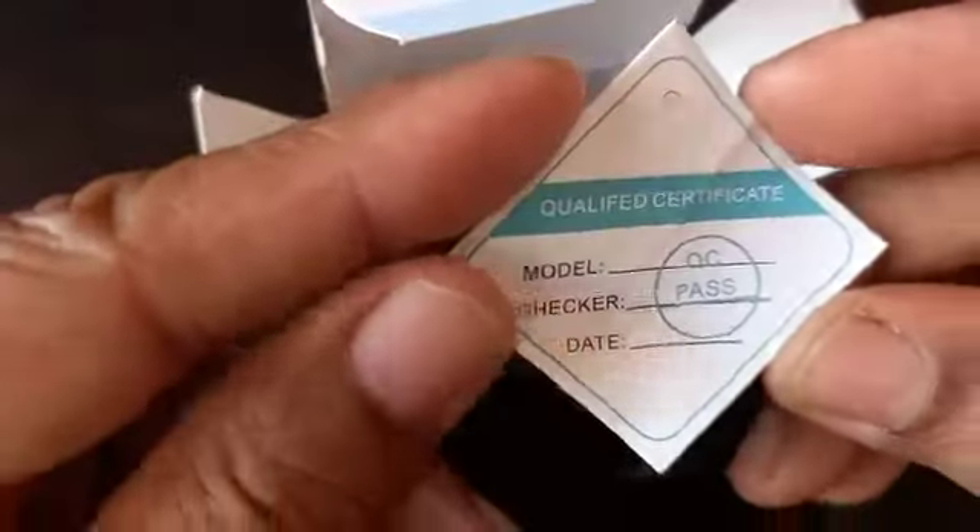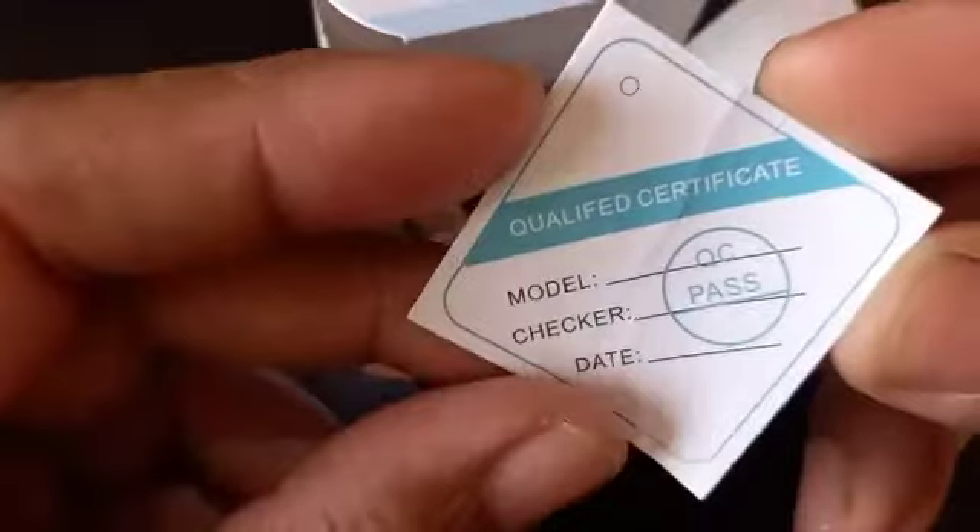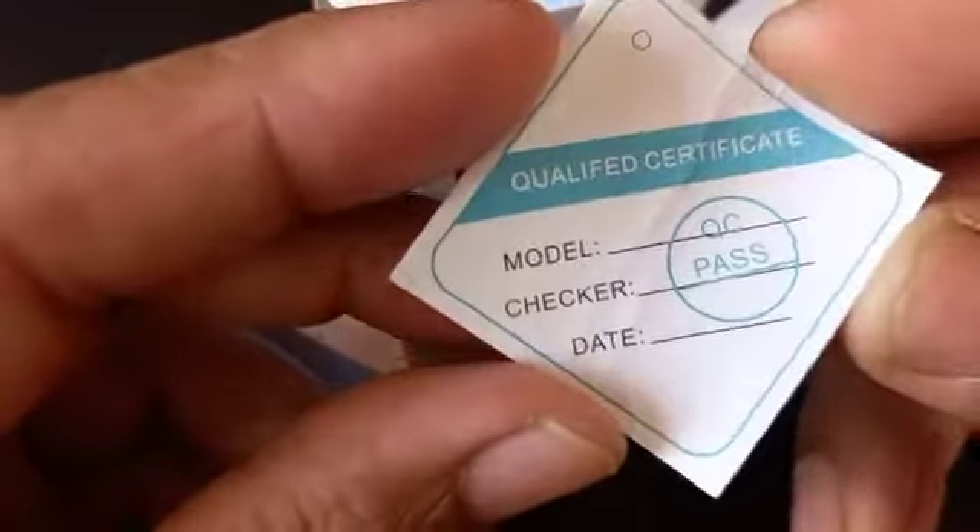Okay, now this is the warranty. I will tell you friends, it gives 6 months warranty. So it is worth buying.